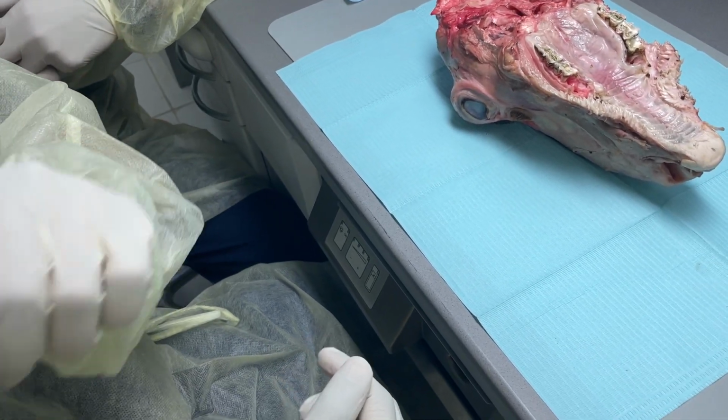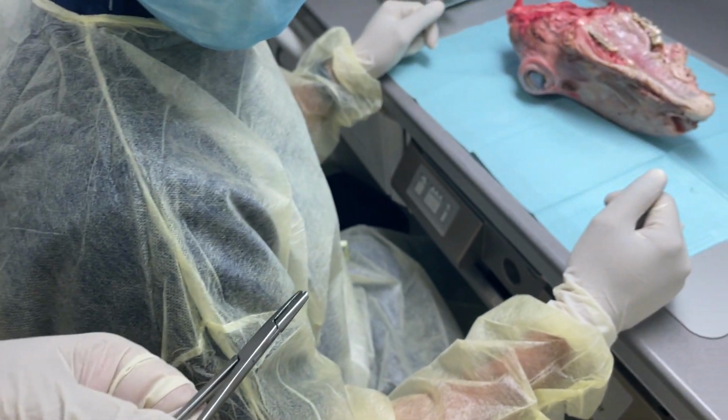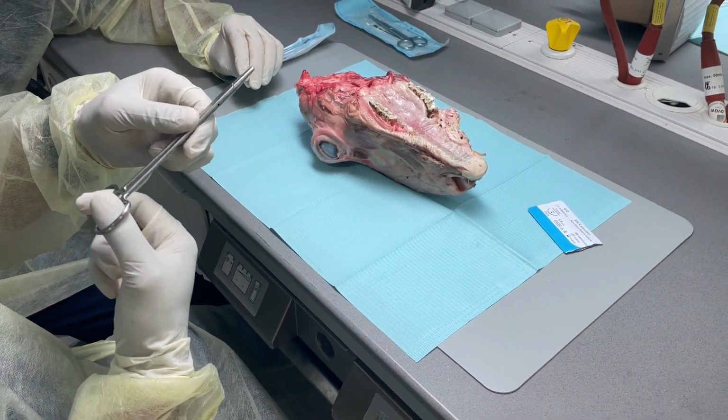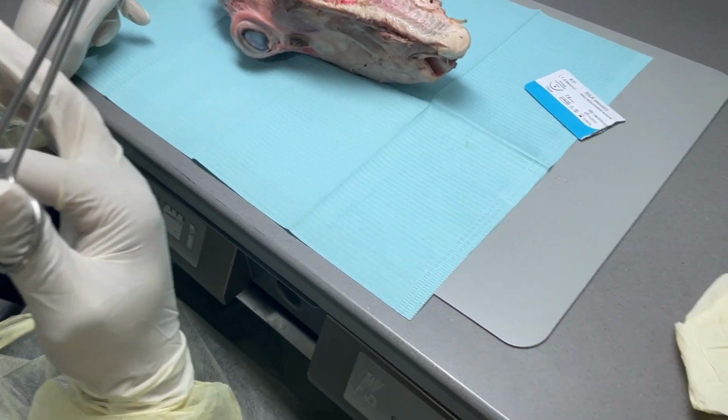Can you show us the grip? I can like this, but how do you do it? See, now it is open. Locked. Then press it again and lift it. Try.